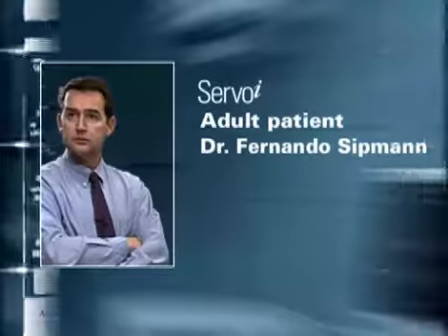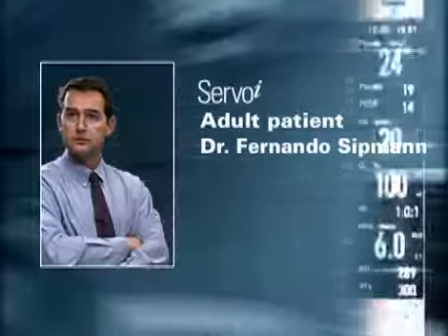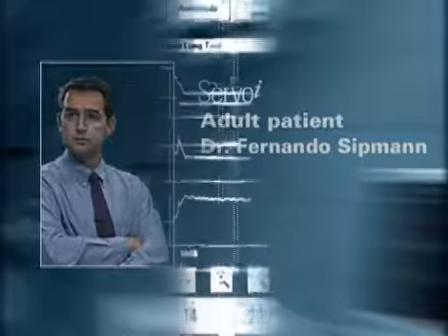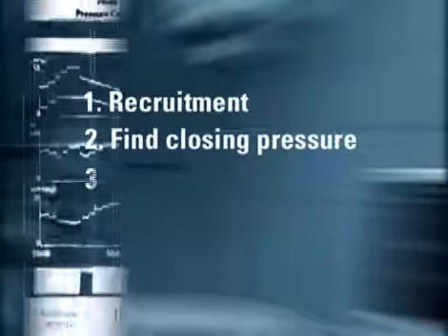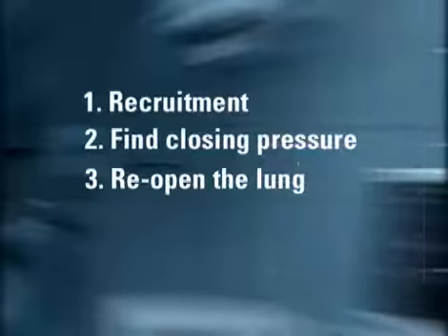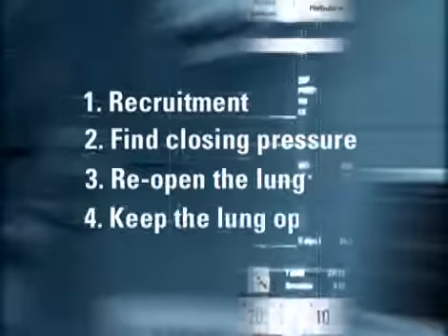After describing the baseline ventilation settings, the physician will lead us through the 4 principal phases of a lung recruitment strategy. Recruitment, find closing pressure, reopen the lung, keep the lung open.